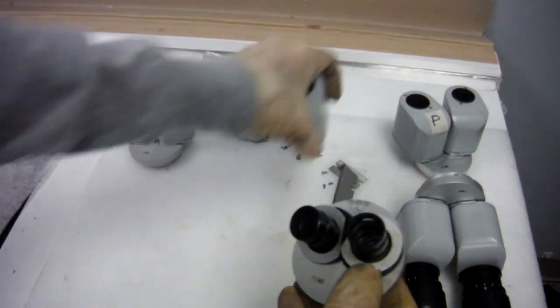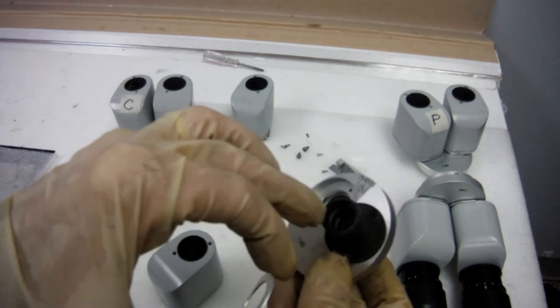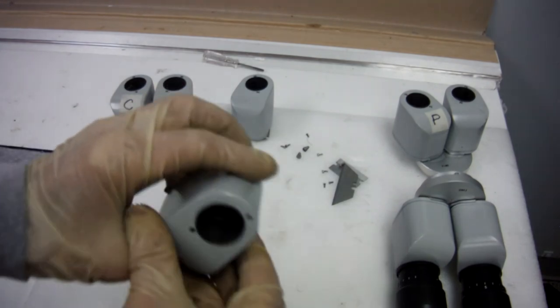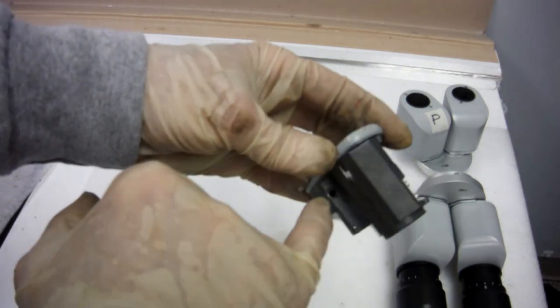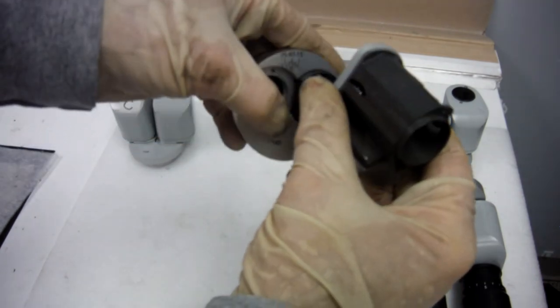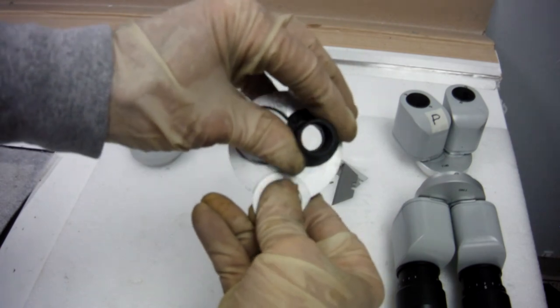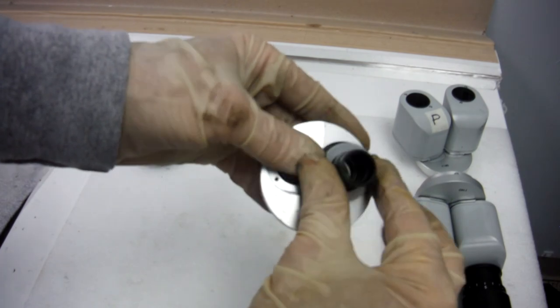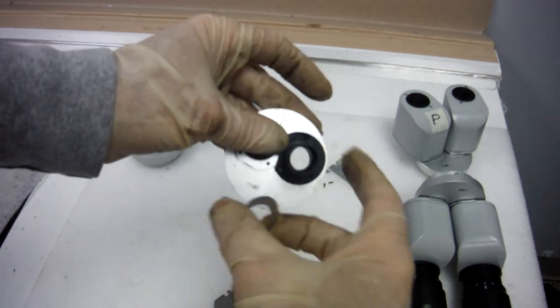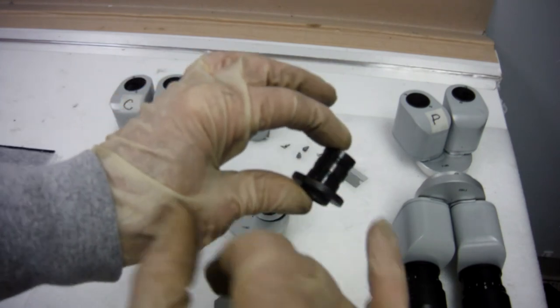And what you might find if something is off, it's usually because of the barrel. The pivot barrel might be bent. So once you have your cover off, you take off this screw right here. Then you can pull it off of the pivot barrel. If your pivot barrel is loose, there's two screws underneath this cap. If you take this cap off, it's glued on. You can tighten your screws up, put that back on. So that's probably where your issue is.